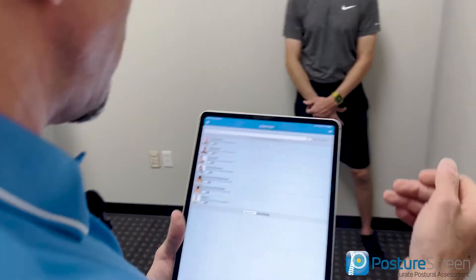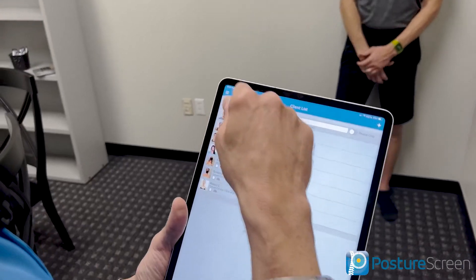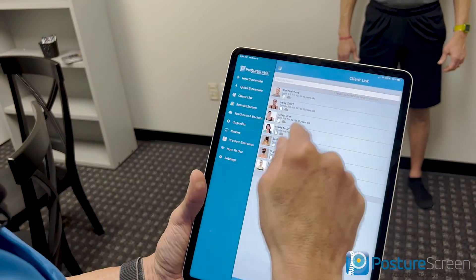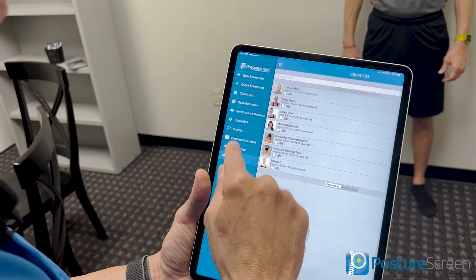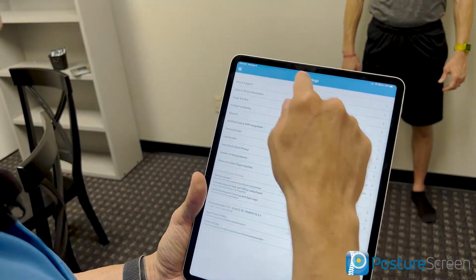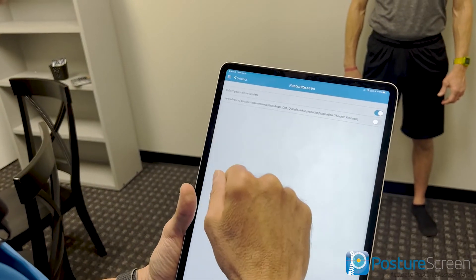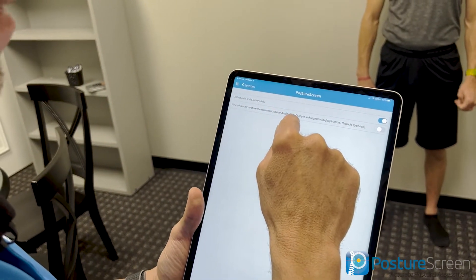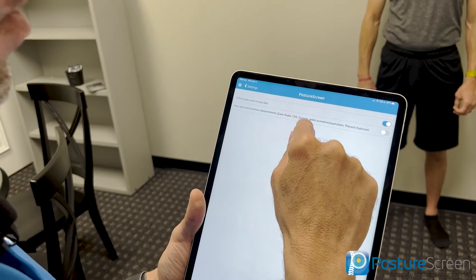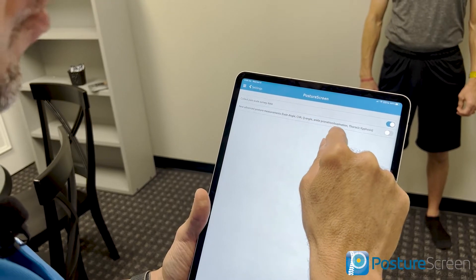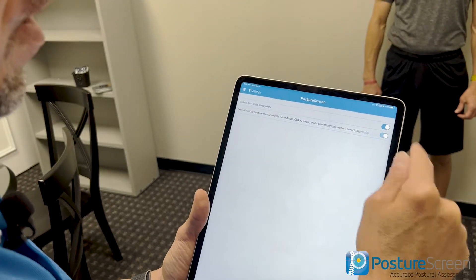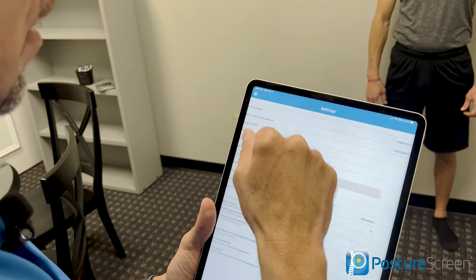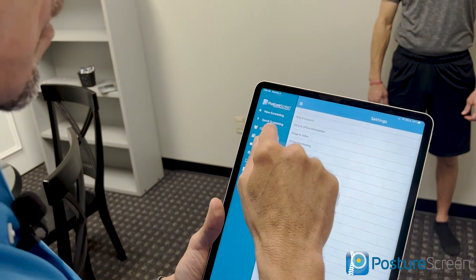To turn on the advanced features, go to the menu, then Settings, then PostureScreen. Notice the new advanced posture measurements: gaze angle, CVA, Q angle, ankle pronation/supination, and thoracic kyphosis. I'm going to turn that on now.